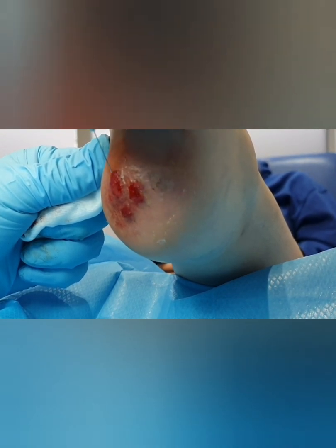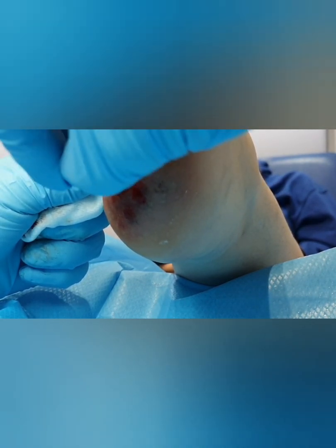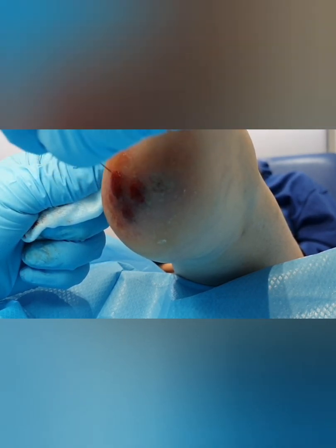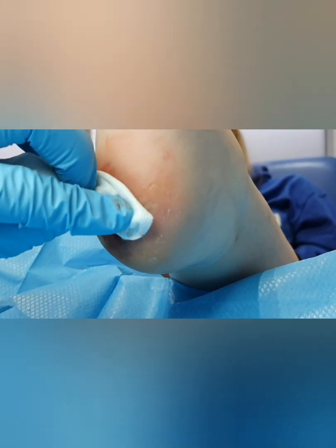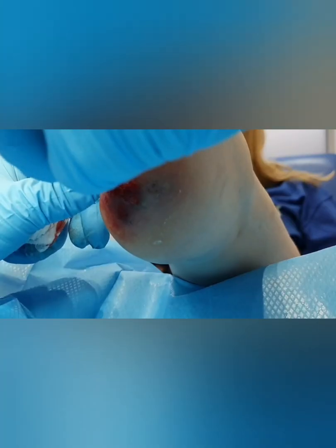So you can just see now that this is starting to protrude a little bit, and you can tell there's not as much resistance going on when I'm popping that needle in. I know it looks like on the screen I'm just wiggling the needle around. I'm not. I am actually removing it entirely from the verruca and then reinserting it. And you can see it's starting to bulge out a bit.